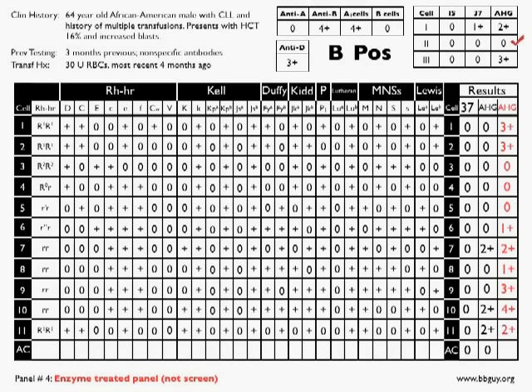Now, very important to recognize, when you do a panel like this, you do not have to go through and redo all your rule-outs, basically. Stay very focused on what we're trying to do. Remember, here we're really trying to look at anti-big C, anti-big K, and anti-Duffy A. Keep your focus there, and let's see if we can figure out what happens with enzymes with these, and if this panel makes sense for what we're proposing.